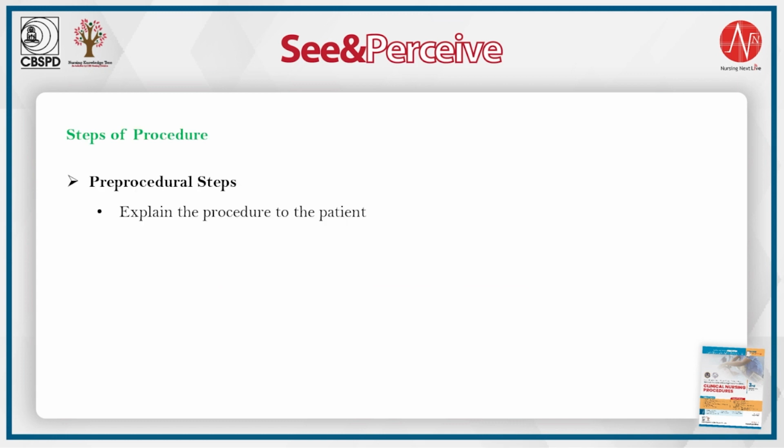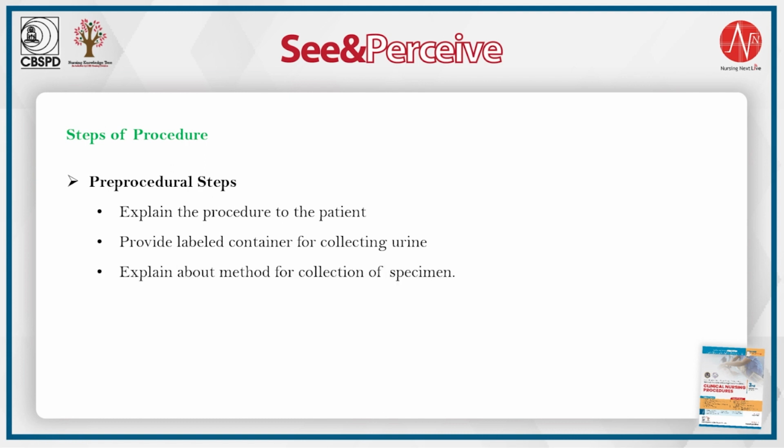Pre-procedural steps: explain the procedure to the patient. Provide labeled container for collecting urine. Explain about method for collection of specimen.